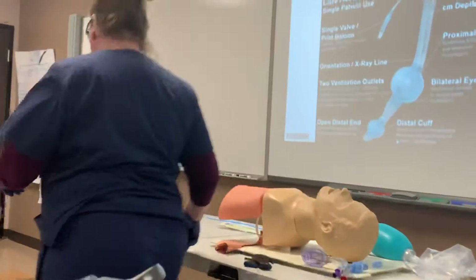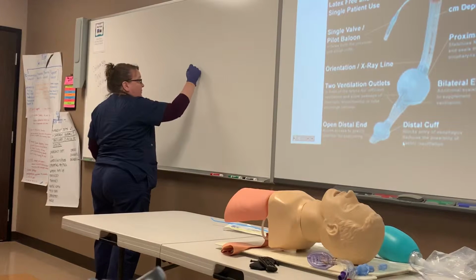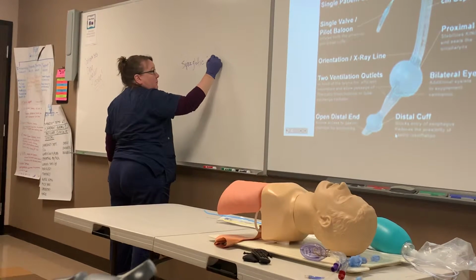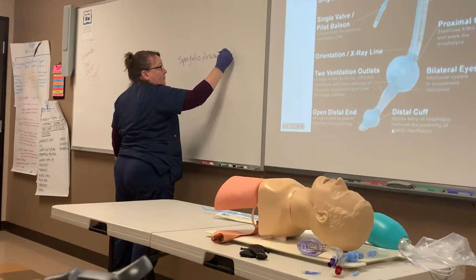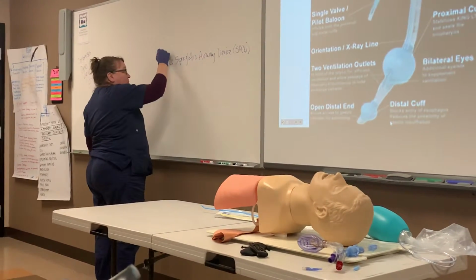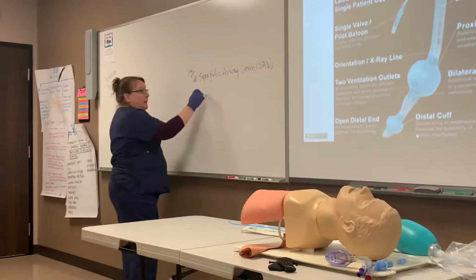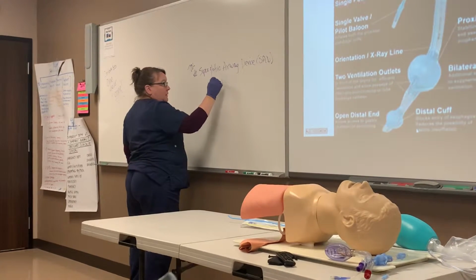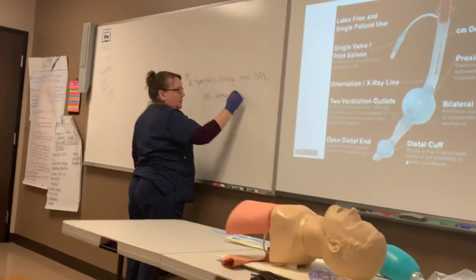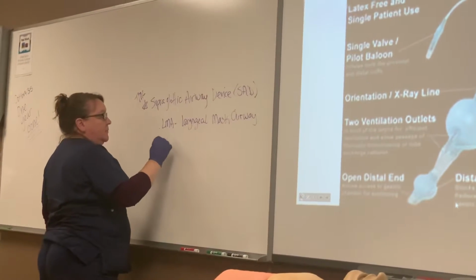The technical name, initials you'll see them called SAD. Remember, this is the name you'll see on the boards on your TMC exam. We don't use any fancy names. So, LMA, laryngeal mask airway, king tube.